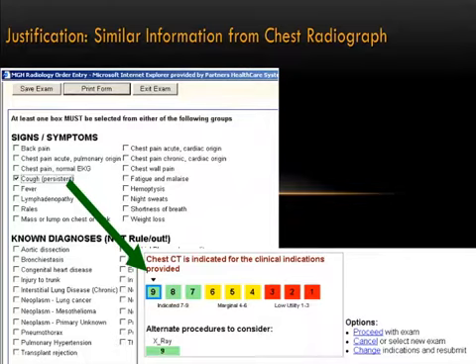The system will actually tell him whether the CT that he selected was appropriate. This is based on the ACR appropriateness guidelines, which have been available for many years now. It will also tell the physician what other modality can give the same information. For example, in this patient who had persistent cough, chest CT was returned as appropriate, indicated, with a score of 9, but so was the chest X-ray with the same appropriateness score.